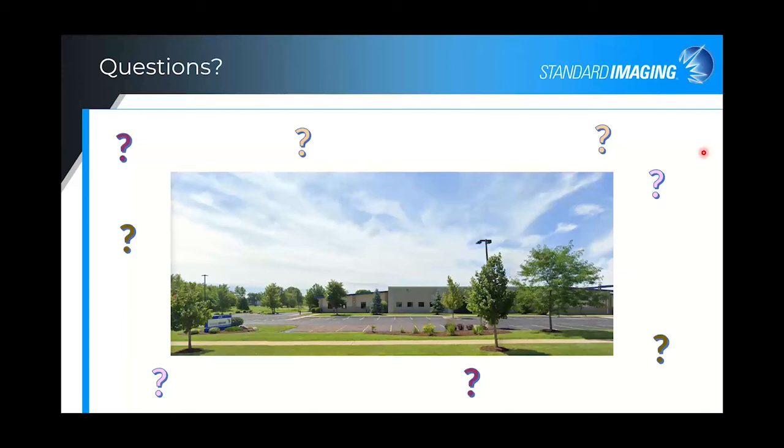So one of the questions is asking, why is the gamma index not 100%? What are the errors? So the RTPlan, I would call it theoretical, right? You have a specific control point and a specific monitor unit, and the Linac itself has a certain tolerance associated with it. Those tolerances are great and they are built in, but there is just some difference in the actual treatment versus the planned treatment.